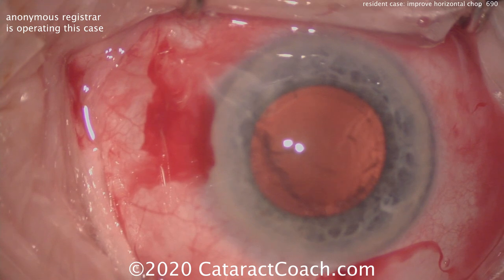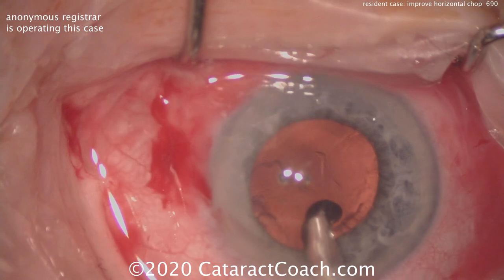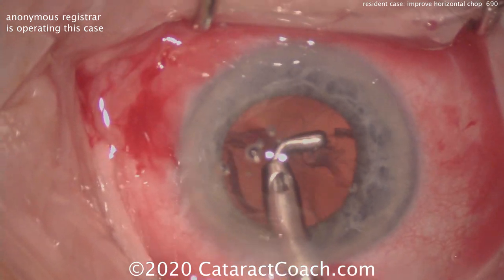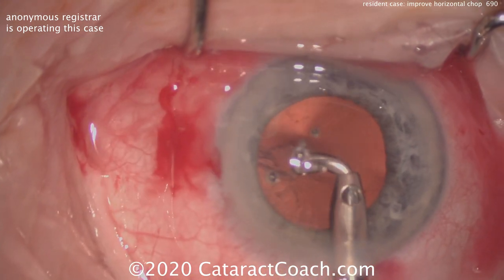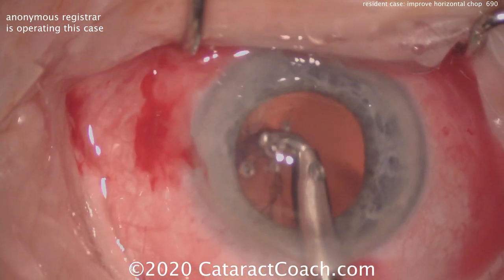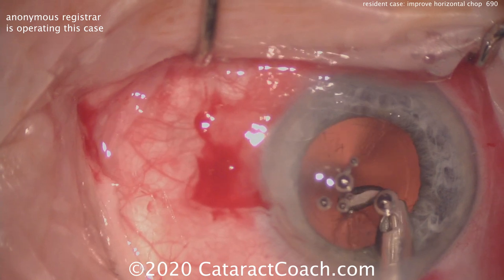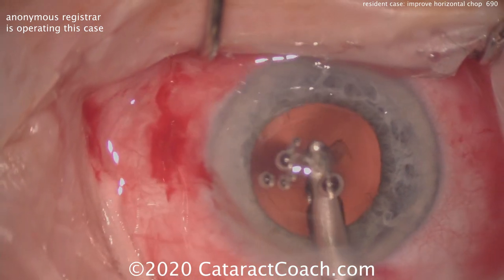So what I'd change here is at the very beginning of the case: make sure you occlude the phaco tip with the nucleus, achieve a high vacuum level — that'll hold the nucleus firmly. Now you can do a chop and then really fully separate the two halves. You'll find that by holding the nucleus still it's a lot easier to chop it. You'll get a more complete chop and an easy separation of the two halves as that chop propagates through the nucleus.